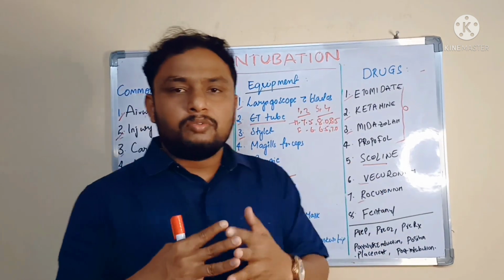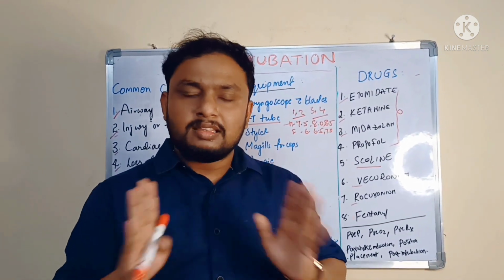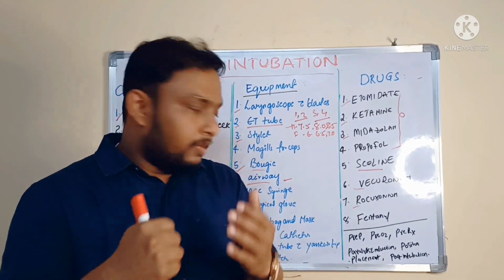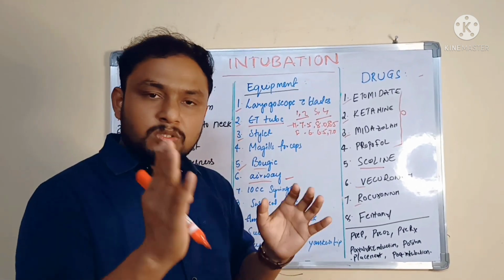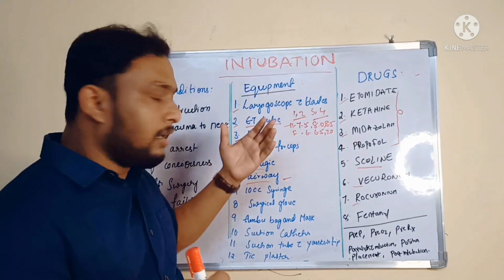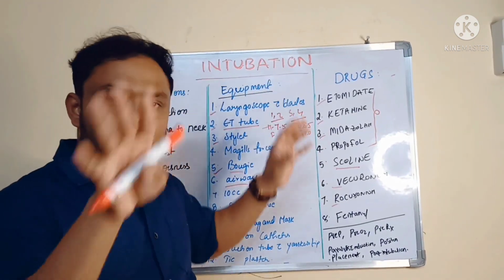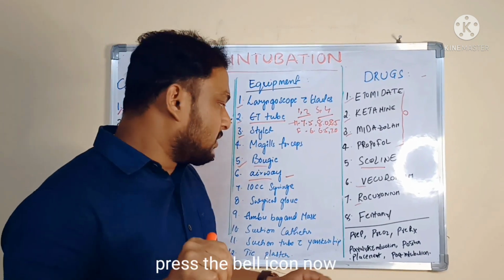Usually, if you observe an intubation, this procedure has to be finished within 10 minutes. Within 10 minutes we can divide it into 7 stages. First, the preparatory phase, which has to be finished within 5 minutes. Under preparation, you need to define the indication for intubation and get ready with all the equipment. All these things come under the preparation part. It takes 5 minutes at least.